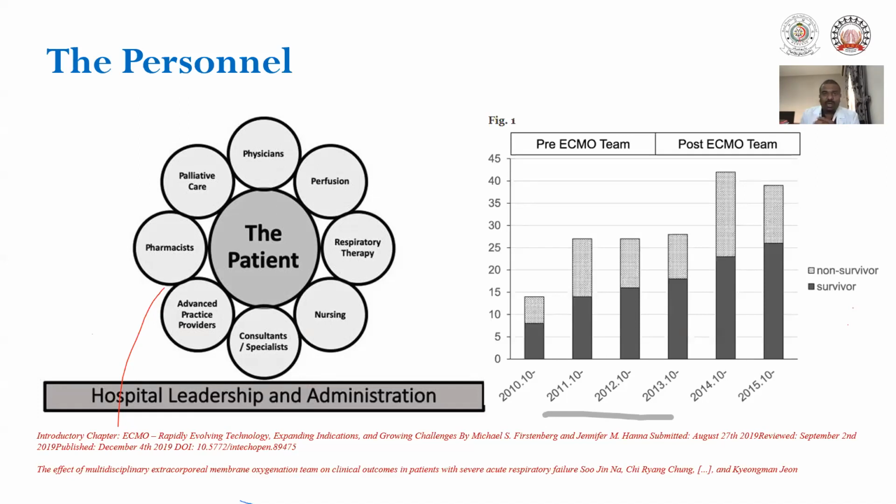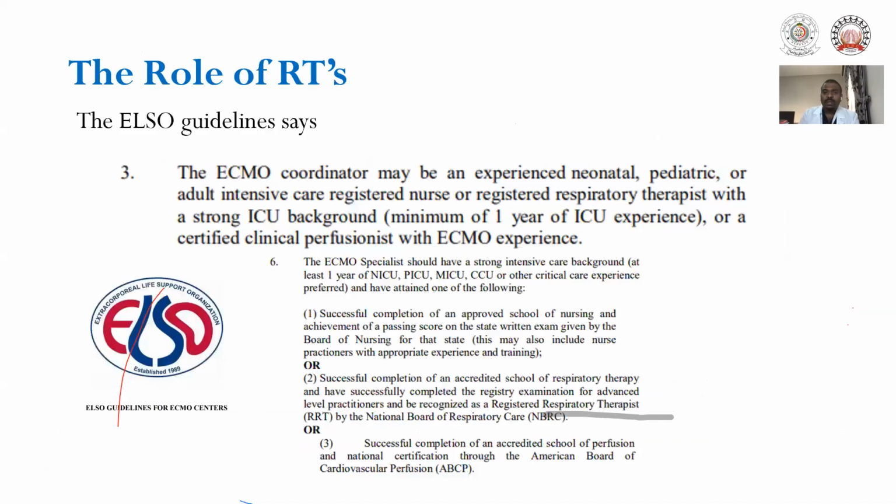The available studies, as you can see on the graph, showed a significant rise in survivors after the establishment of an ECMO team, with an obvious and concurrent rise in the total number of ECMO cases. Making up an ECMO team really varies across institutions. Importantly, this is my message: all members in the team, regardless of their experience, education, training, degrees, and titles, need to have respect and trust and place value on the contribution of all the members.